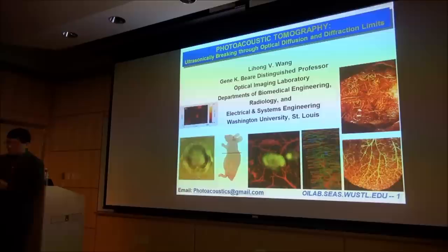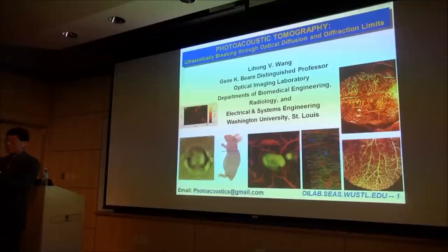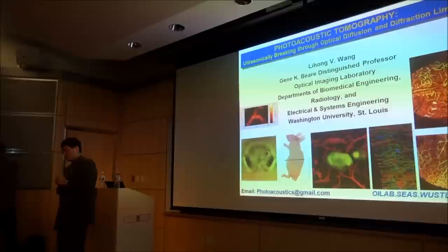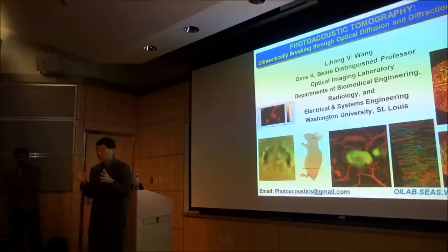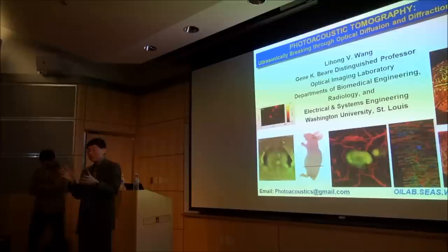So the fluence, as you go deeper and deeper, does drop. So the laser light at different depths will receive different fluence levels. So even if you have the same absorption coefficient at two different depths, they will return different photoacoustic signals. So there are non-invasive approaches several groups are studying. One way is to combine diffuse optical tomography with photoacoustic tomography. So DOT allows you to map the fluence distribution in a blurry way, but it might be adequate because the fluence distribution is blurry anyway.